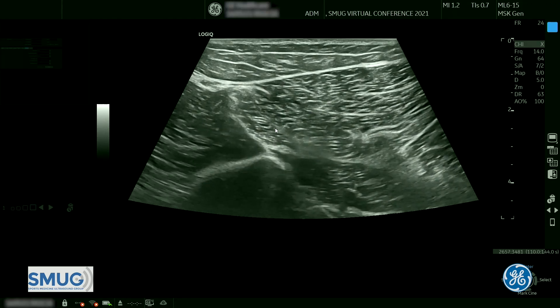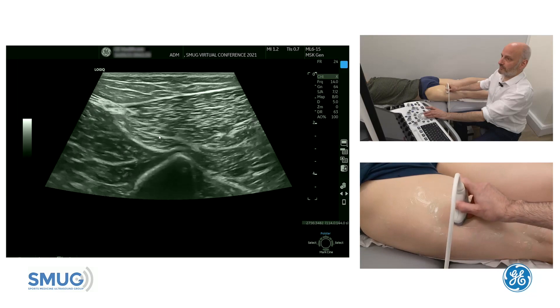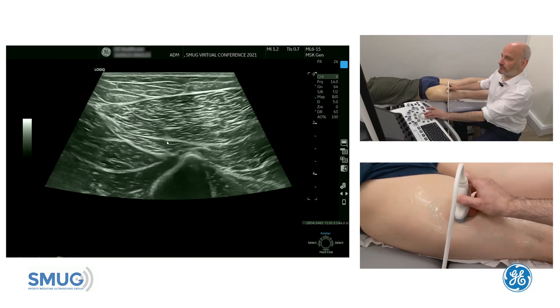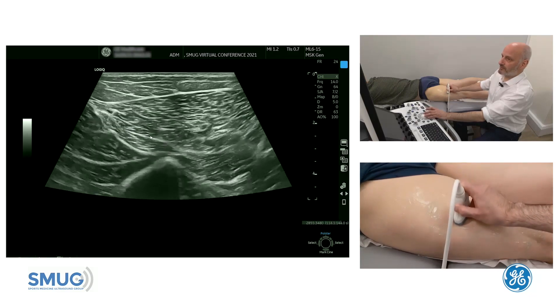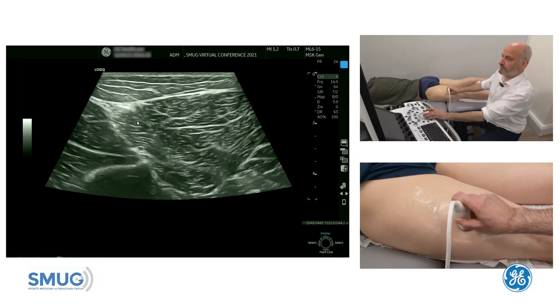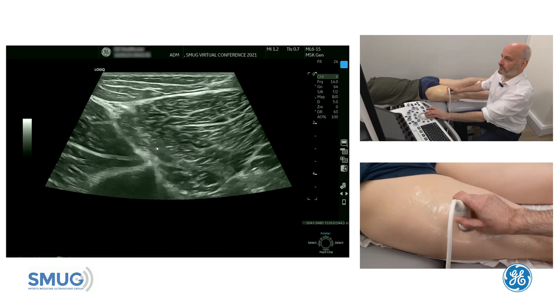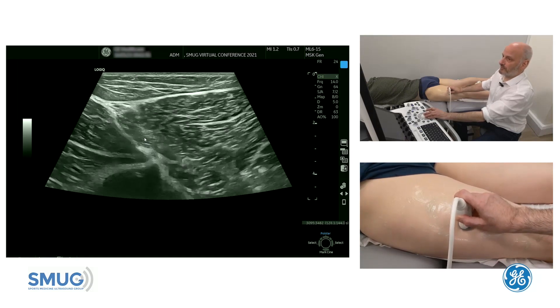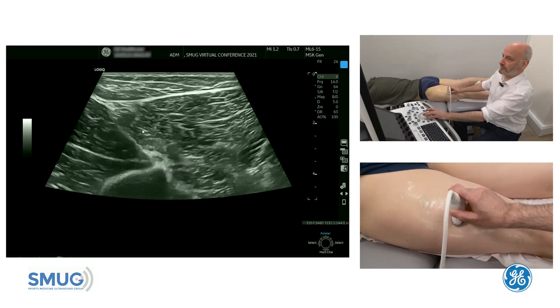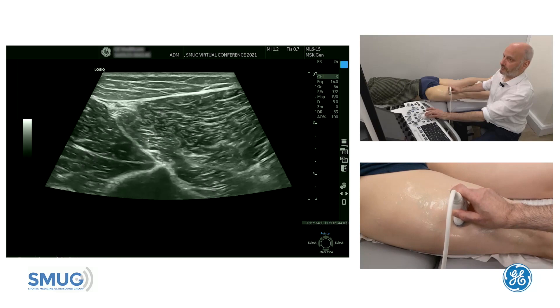Use your probe skills here to optimize that — if you flatten the fascial plane out you can see it beautifully as a bright line, but if it's in a more vertical position you lose that, and sometimes it can be very difficult to identify that compartment. Another trick is to slowly push your probe down, and then you can see that there are three compartments all moving in their own way. So even if you don't see the fascial plane, you can see there's a column moving independently.